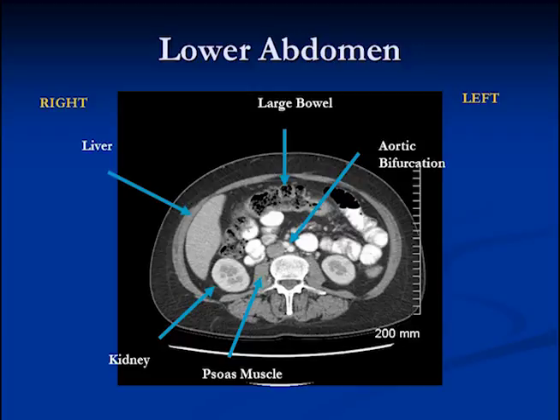Here we have the aortic bifurcation. The aorta has bifurcated into the common iliac arteries, and right next to it we have the inferior vena cava.